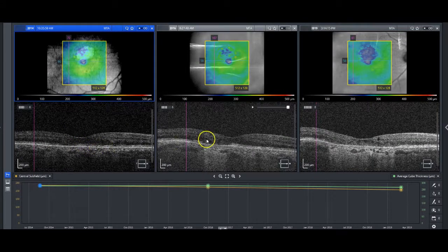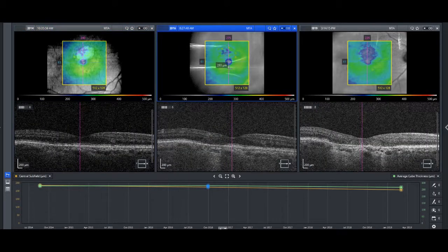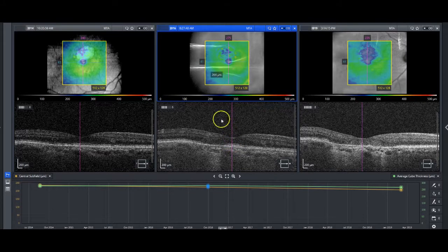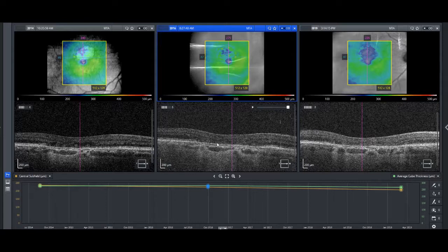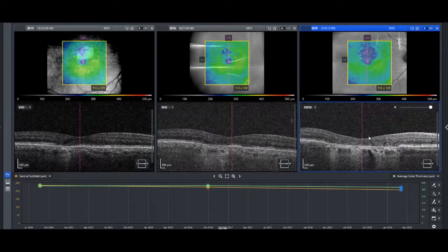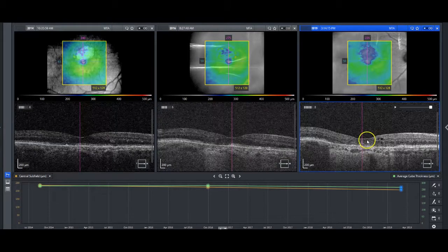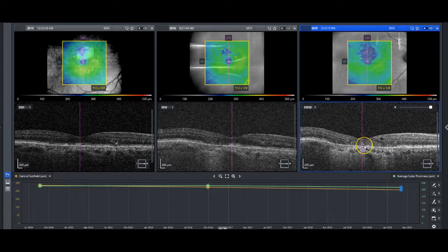But if you look at this patient over time, you'll see that here the ellipsoid zone is okay within the fovea, but you're already starting to get a little bit more changes just to the temporal aspect here. And if we scroll around again, you can see substantive geographic atrophy. Then finally looking at the 2019 date, going back towards the fovea, you can really not find much ellipsoid zone here. I can tell you that it won't always correlate initially with vision — this patient was still 20/40 in this eye, so there's probably something there that we just can't quite pick up.